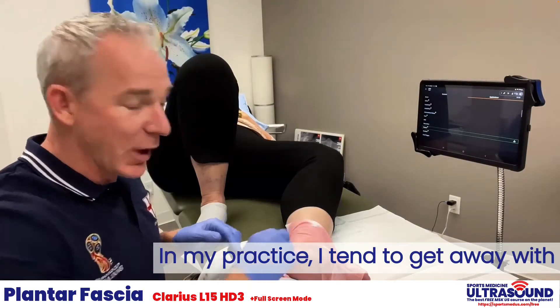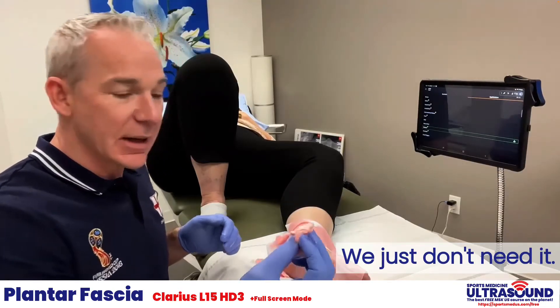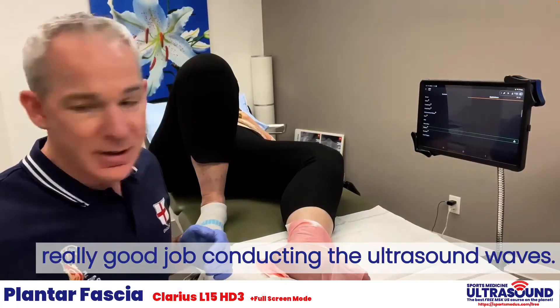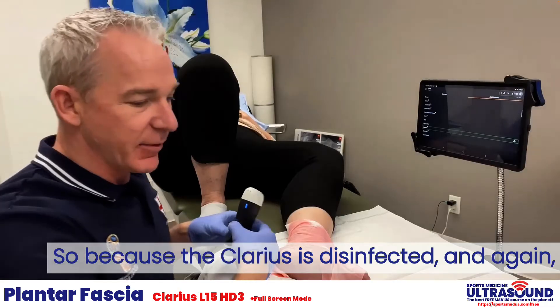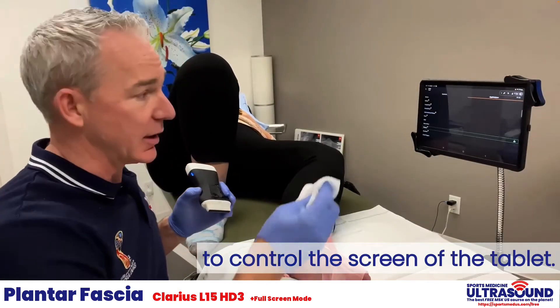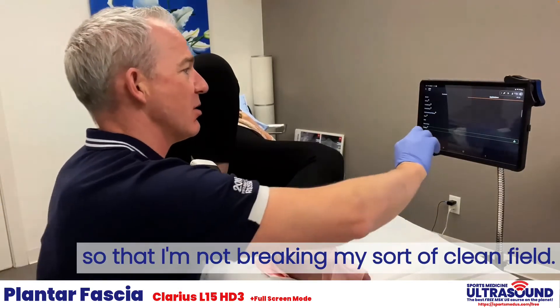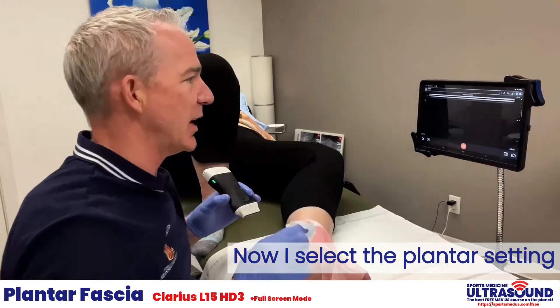In my practice I tend to get away with not using a ton of sterile ultrasound gel — we just don't need it. It seems that the skin disinfectant does a really good job of conducting the ultrasound waves. I've got the Clarius disinfected, and to control the screen of the tablet I use a disinfectant wipe to touch the screen so that I'm not breaking my clean field.